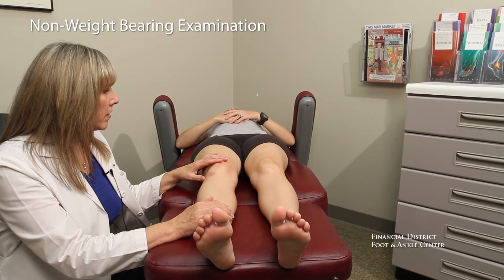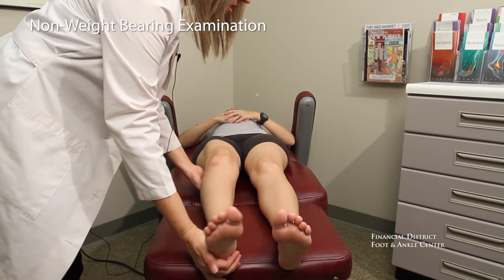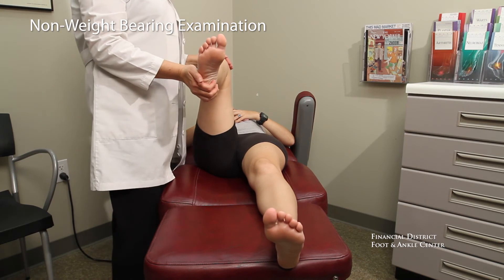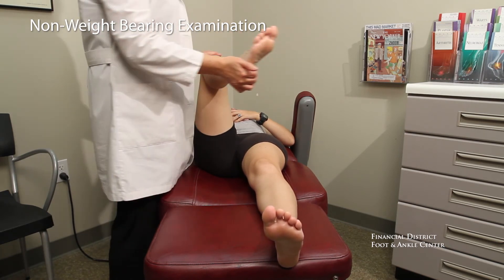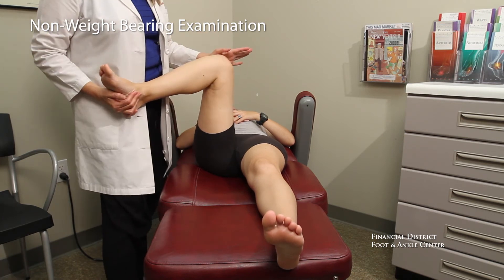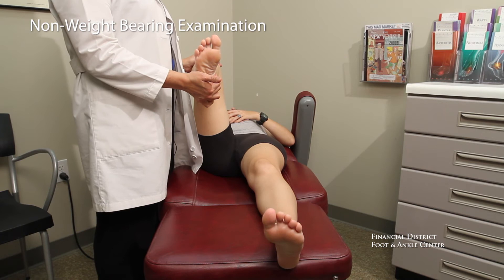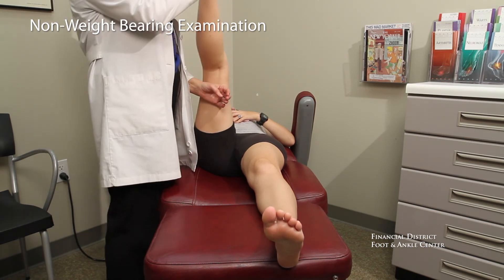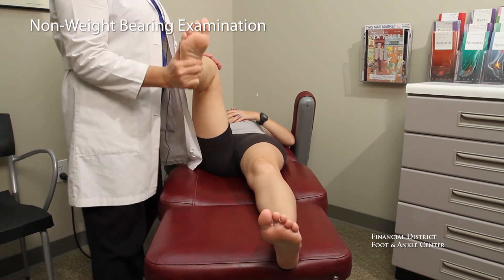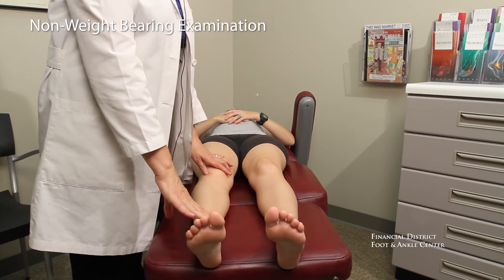A few of the measurements that we take: we'll check hip range of motion. In this case, Shauna has much more inward hip mobility than outward, which can cause some strain on the knee. Hamstrings — good. And then we'll take several different measurements of the feet and the ankles.